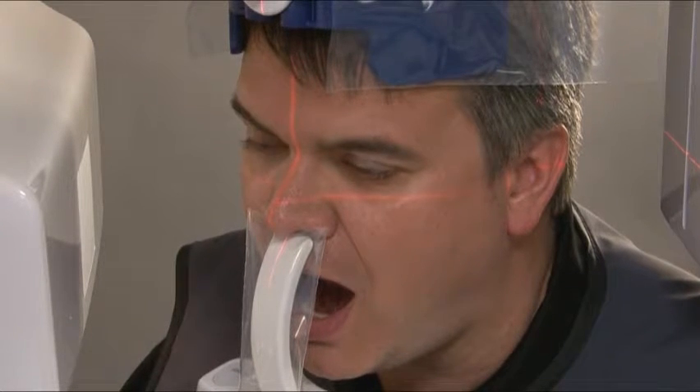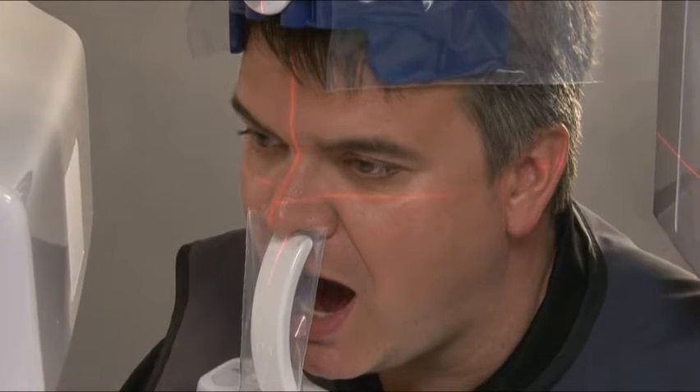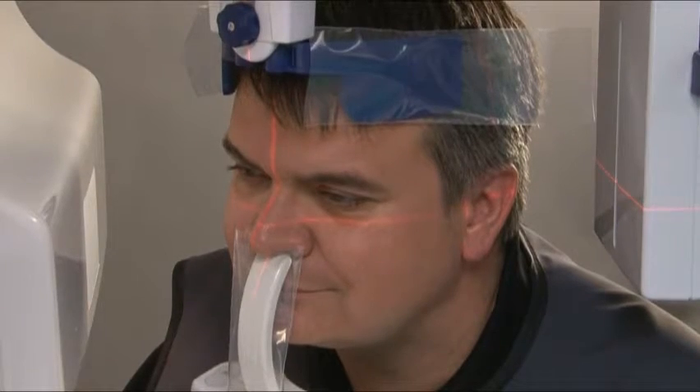For TMJ open, ask the patient to open their mouth to the fullest extent possible and remain still for the duration of the exposure. For TMJ closed, ask the patient to place their teeth together, press their tongue against the roof of their mouth, swallow, and remain still for the duration of the exposure.